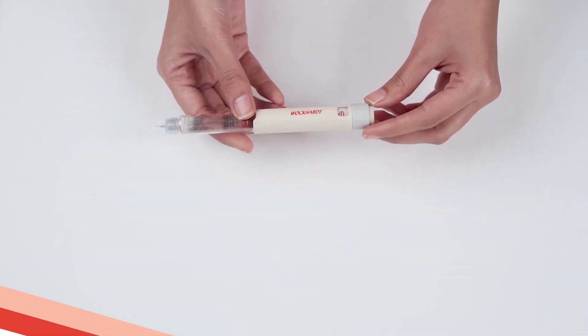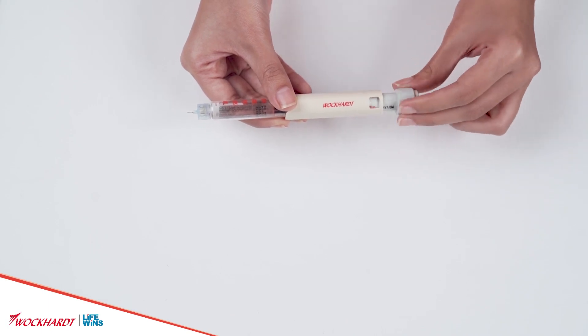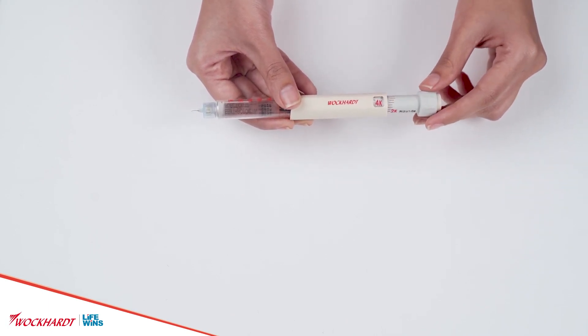Now dial 3 units by rotating the dose dialer in a clockwise direction. The dose indicator indicates the strength of erythropoietin dialed as recommended by the doctor.